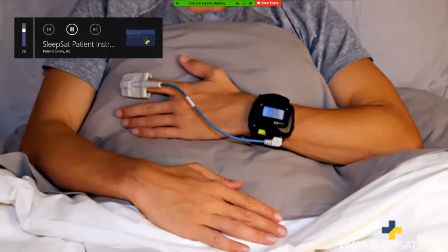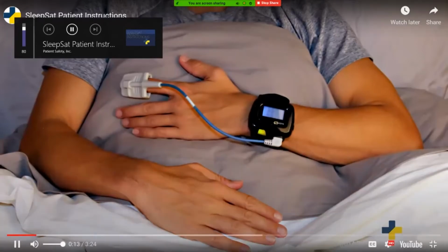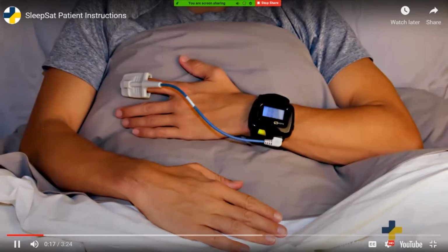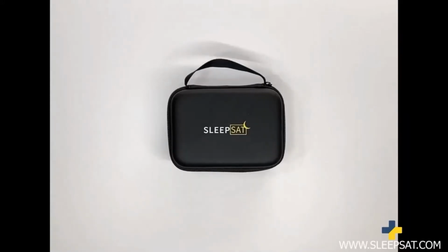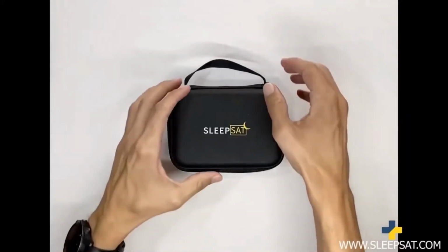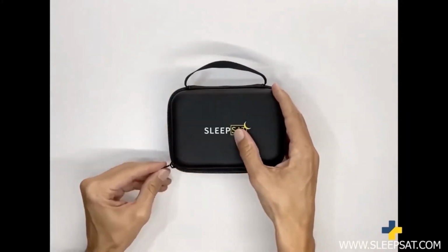An oximetry test has been ordered by your clinician to monitor your oxygen levels and heart rate while you sleep. There is no alarm on the SleepSat device, and it is not intended for real-time monitoring. For best results, remove nail polish. Avoid laying on the hand with the sensor, putting it above your head, or tucking it underneath a pillow. Turn the oximeter on only when you're in bed and ready to fall asleep. If the finger sensor irritates your finger, switch to a different finger. Charge device fully between nights. To begin, take out the patient instructions, finger sensor, and the SleepSat device. Remove your watch and any jewelry you are wearing as well.